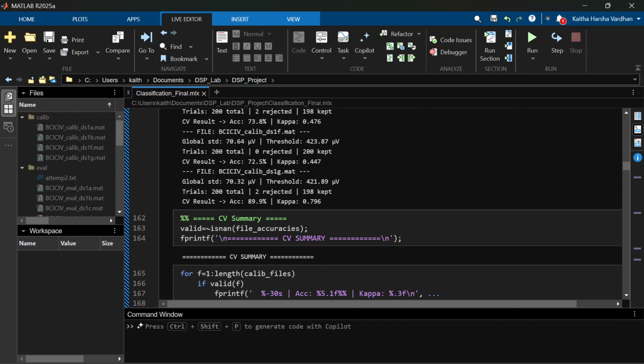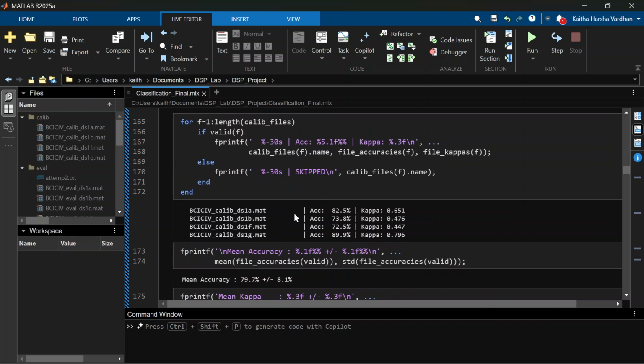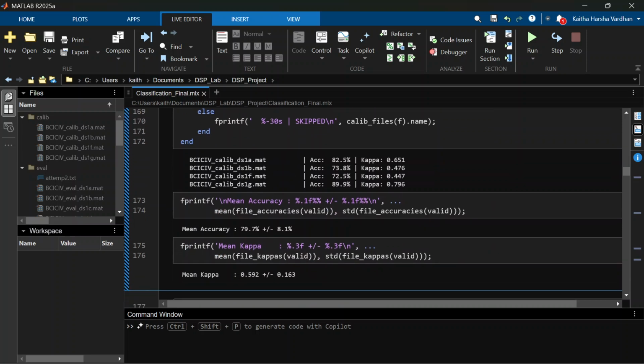So these are the results on all the 4 files, the voltage and the threshold that we get. These are the individual accuracies for all the files. This is the mean accuracy, and this is the mean kappa. Both are figures of merit for our work. By seeing the mean accuracy, we can say that the algorithm is nearly 80% correct, and kappa is also a figure of merit, where we prefer a kappa to be close to 1. So it's a decently good kappa. Thank you so much guys for watching this video.